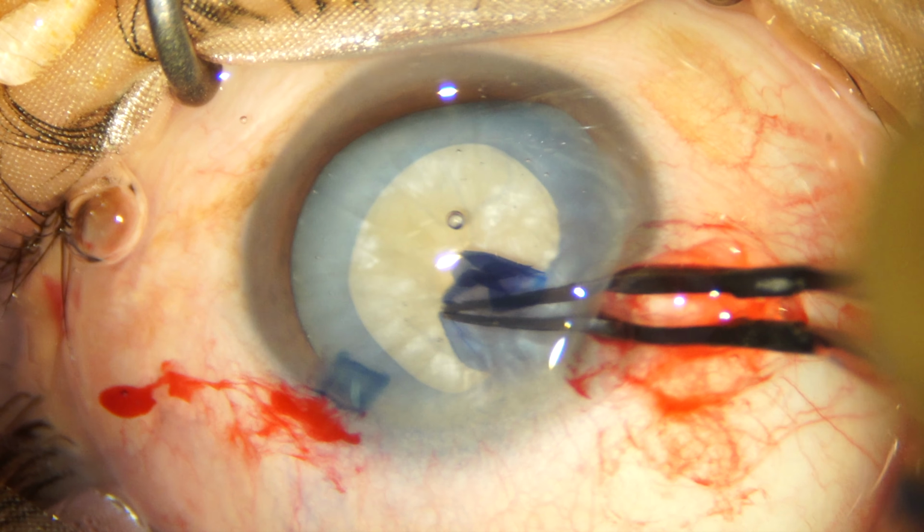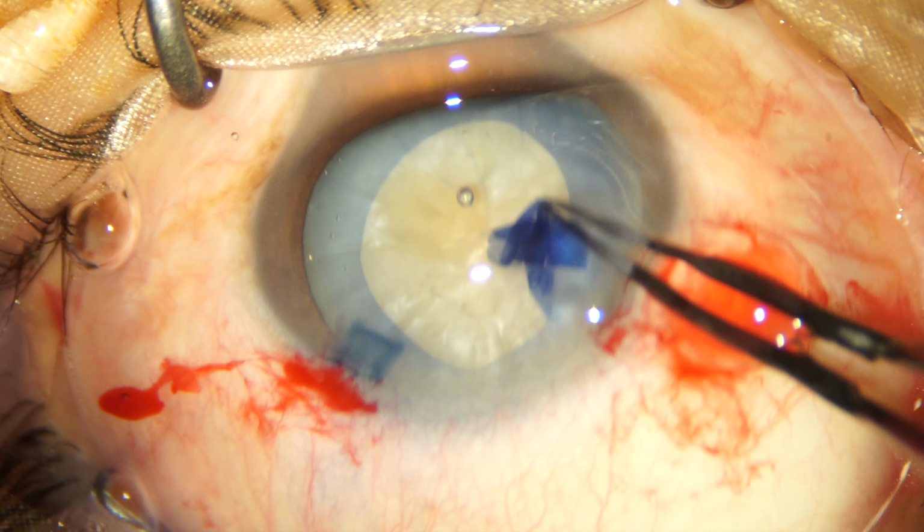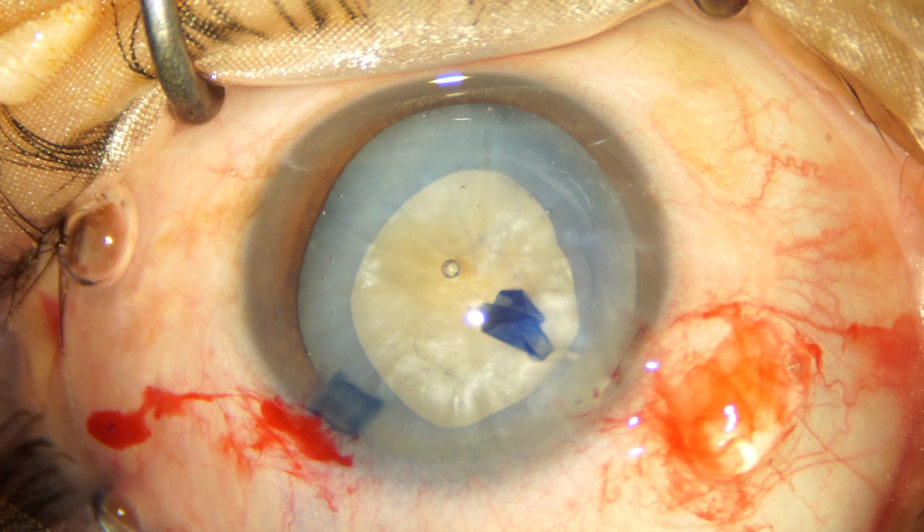At about the 1 o'clock, I nearly had a radial extension, but I quickly pulled the capsular flap back towards the center.